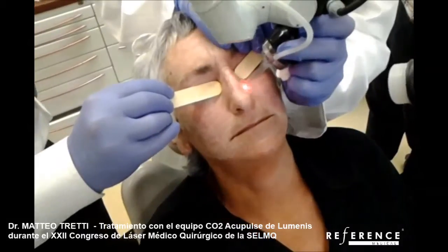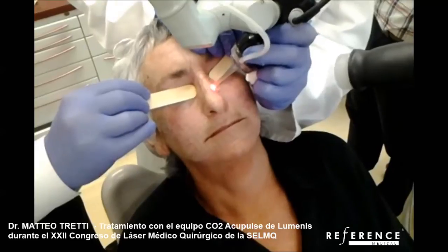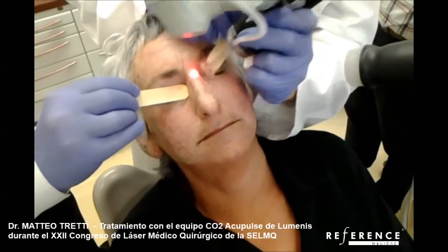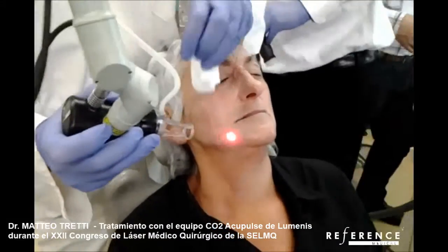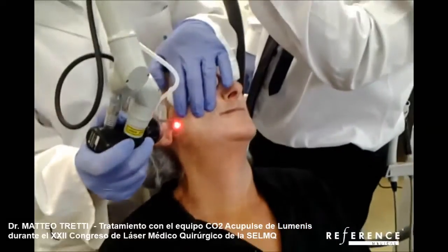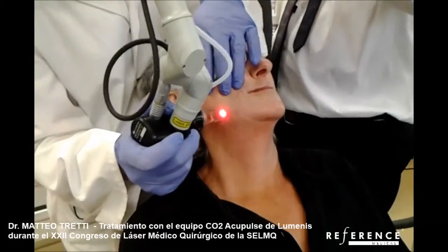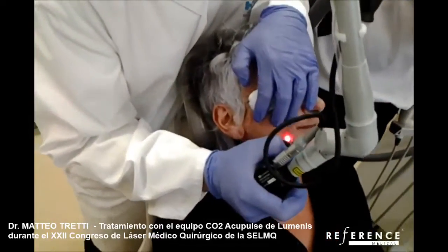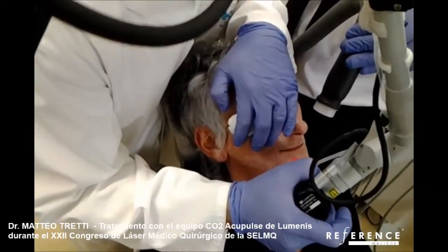I really like using wood tongue depressors. Wood is a natural material, not plastic, so it can absorb the rays of the laser — which is important for the safety profile of the treatment. I started a year ago applying Vaseline, but Vaseline is a very heavy medication, so I moved to a brand cream called Aquaphor. Recently a lot of post-laser products have been produced, and I will show later what I will apply.